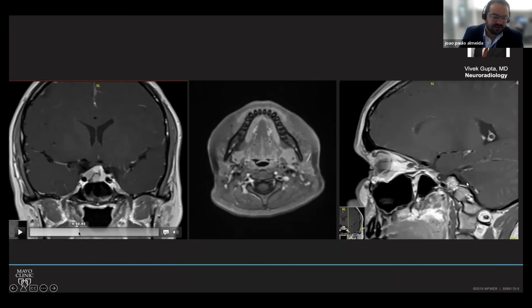You see that this tumor, my impression is that it was not really extending laterally. I would consider this as a Knosp 2 in this relationship. So although there was a very small chance of a real invasion of the cavernous sinus, in my opinion, it's not zero. And quite often, if we were looking at the images closely, this could even be a 3A, based on this lateral extension into the superior compartment, but I'm gonna see in the surgery, it was more like a 2.